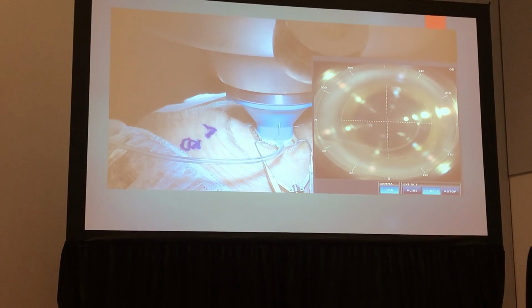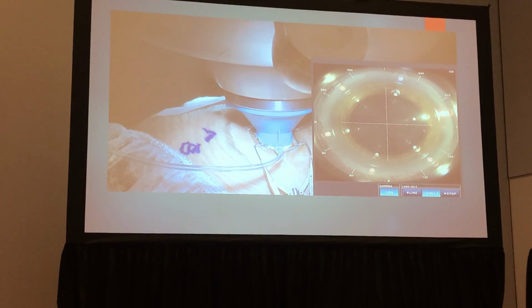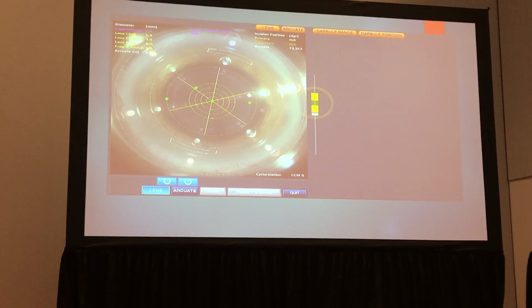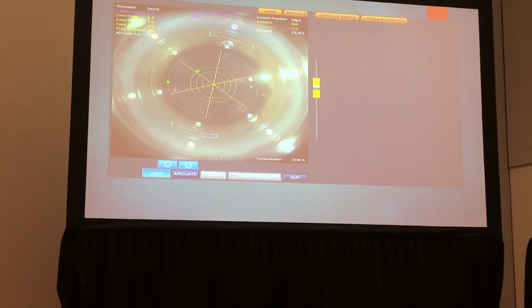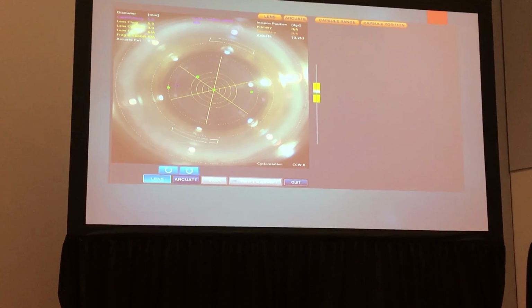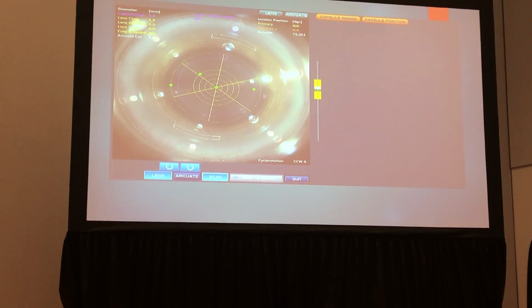We can go ahead and have vacuum. Go ahead, PI suction. So good, we have good suction. I don't have any bubbles there. So I'm going to go up to the top of the green here. And once we get there, we're going to take a picture. You see her arc, superior, inferior. So everything really looks perfect. And she has a nicely dilated pupil. Everything is well centered there.